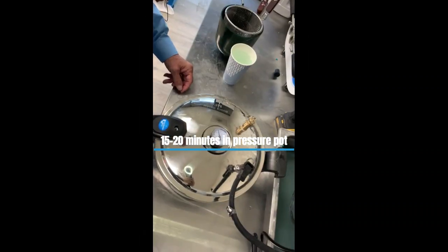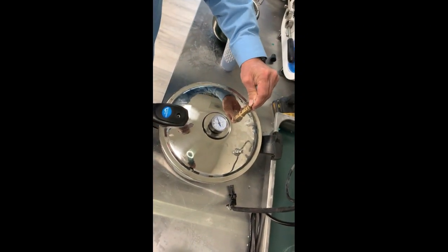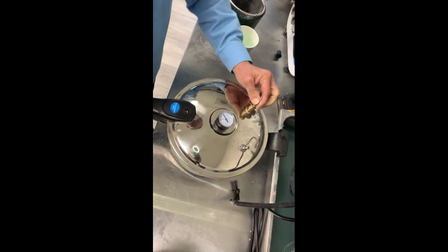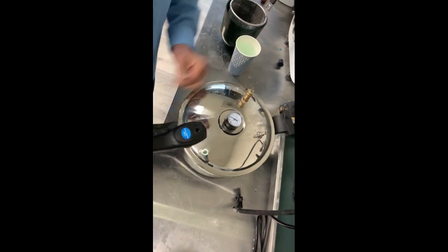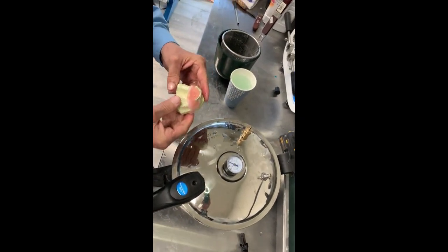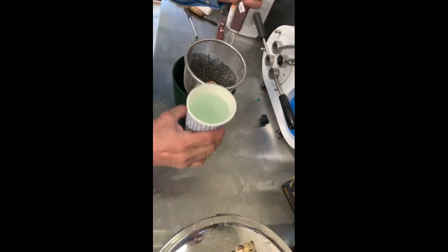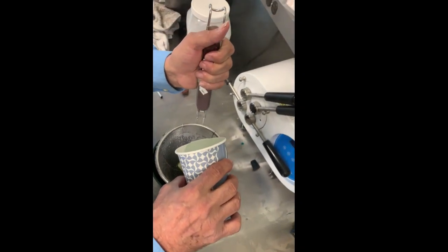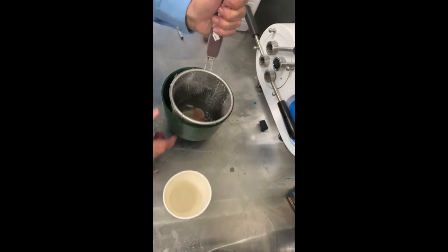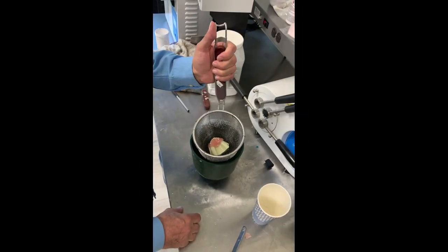Okay, and after 15-20 minutes, go ahead and release the air from the pressure valve. Remove the partial. Now you're ready to place it in your boil out tank. I do not have a boil out tank, but I have water that's very hot right now. You want to place it in the boil out tank to remove all the wax from the model. Place it in water for about a minute or 2.